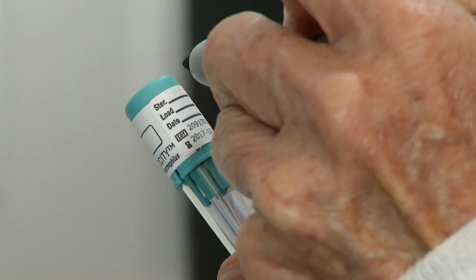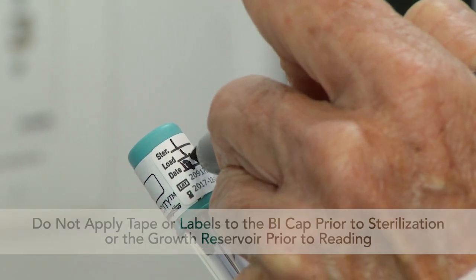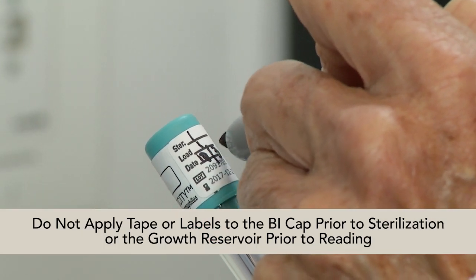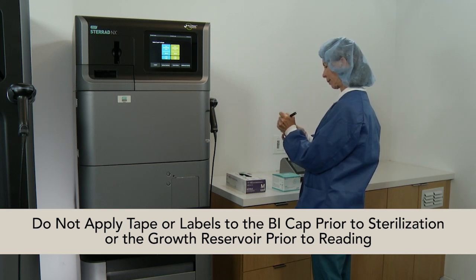Next, record the sterilizer ID, load cycle ID, and date on the cap label. Do not apply tape or labels to the BI cap prior to sterilization or the growth reservoir prior to reading.